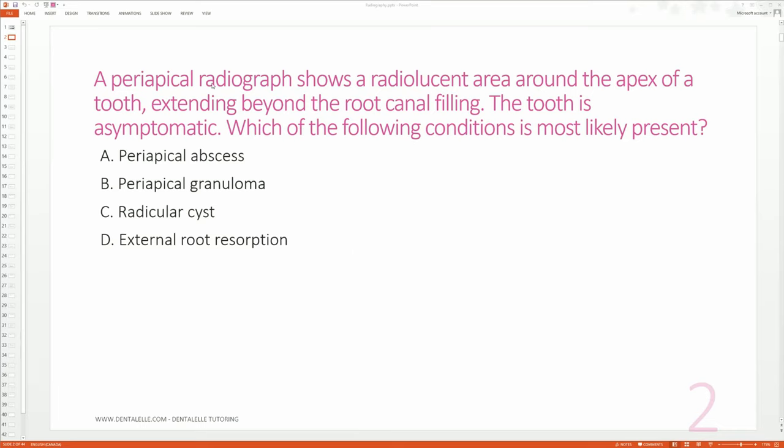With case studies, you have to look at every single part and think about that critical thinking. A periapical radiograph, that's the first clue—it's not a bitewing, it's not a pan, but it's a periapical. Then it shows a radiolucent area. Is that white? Is that black? Do you guys remember? It's black around the apex.